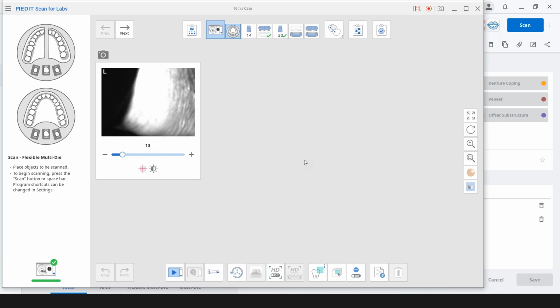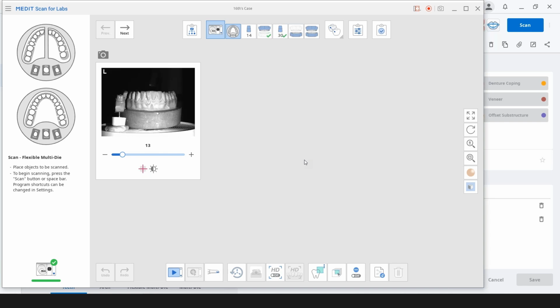Now, Jeff, what would happen if you mentioned the buccal should be facing the camera? Would it still scan if it wasn't? Does it create issues, or is it just giving you more information so it's helpful to do it that way? I think you mean the lingual. You want the buccal to the camera. Yeah, the lingual, it will still pick it up. It'll be fine. Okay. It's just a preference for alignment and so forth.